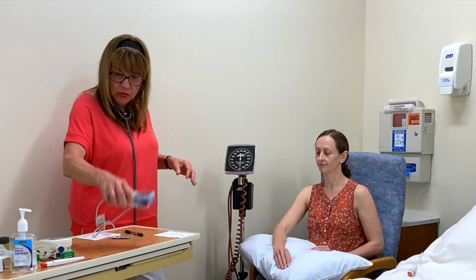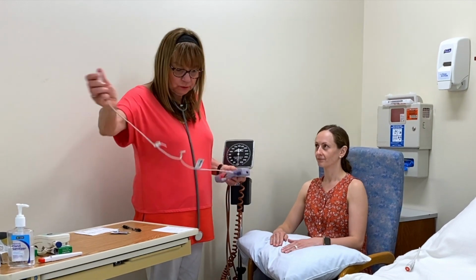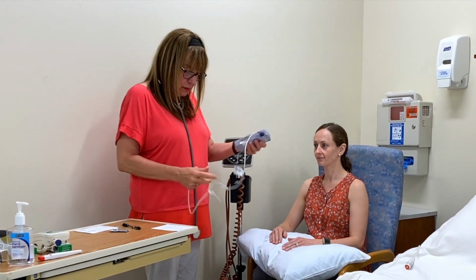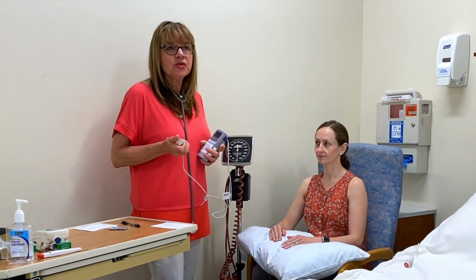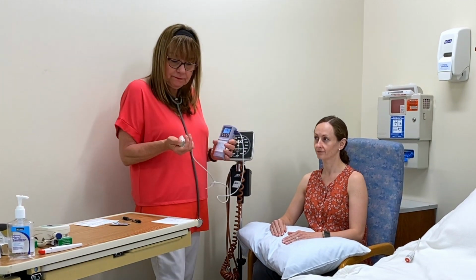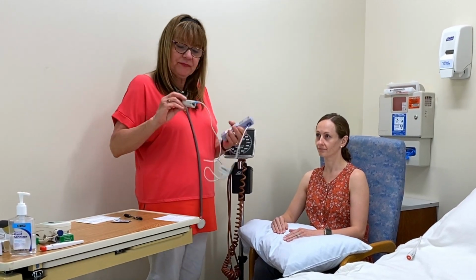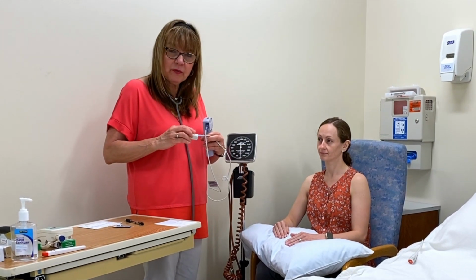The last thing that I'm going to be doing on Monique is her SpO2 reading. This SpO2 monitor will also measure her pulse rate, but it's not as accurate as a telemetry monitor or a radial or apical pulse. So you're going to turn it on, and remember, most of them will show you where the finger goes.